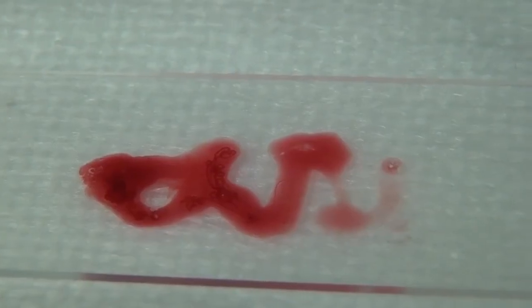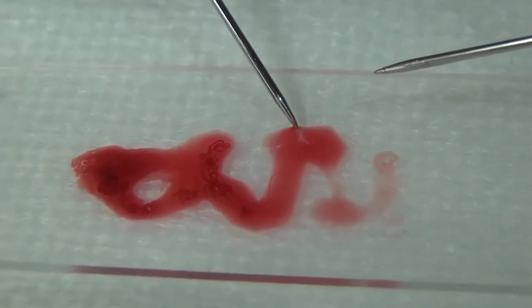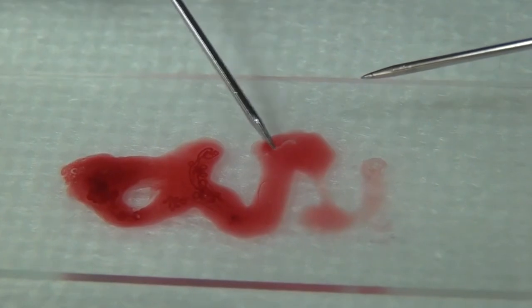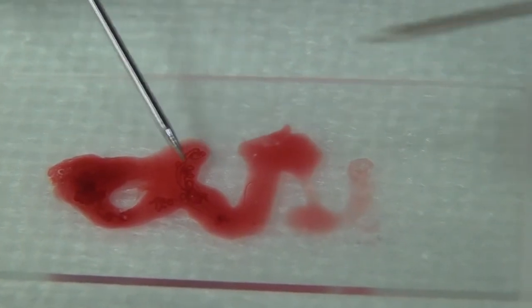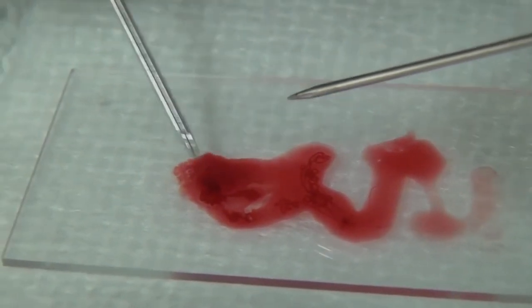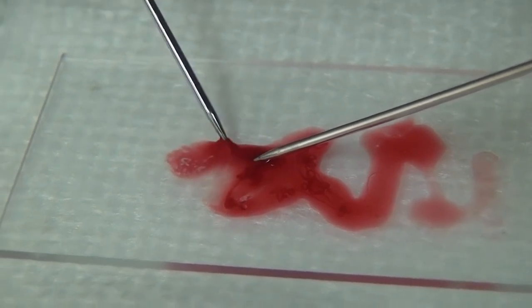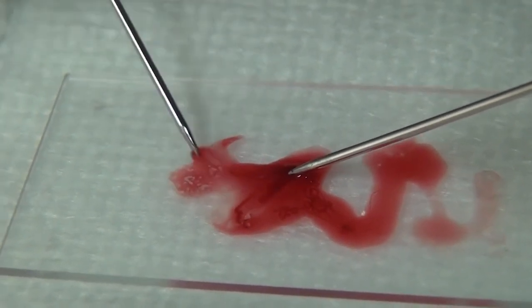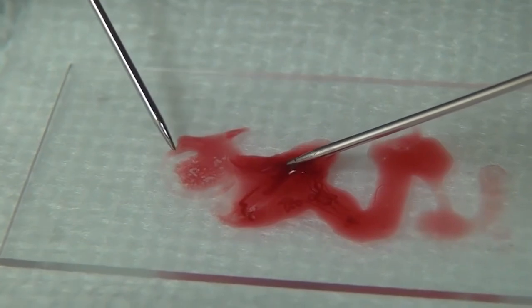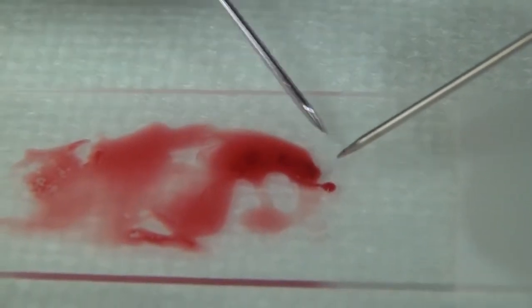Okay, so looking at this one, there's some microcore here. You see this white material that moves around? That's actually some core. If you look way over here, there's some actual microcore. Look at that. You see that? That's really good specimen right in here. That's really good microcore. Okay, so in this pile there's some blood and there's some core that has some height.